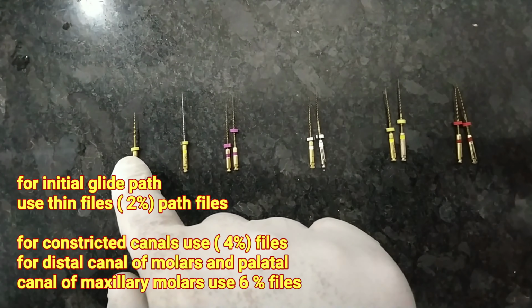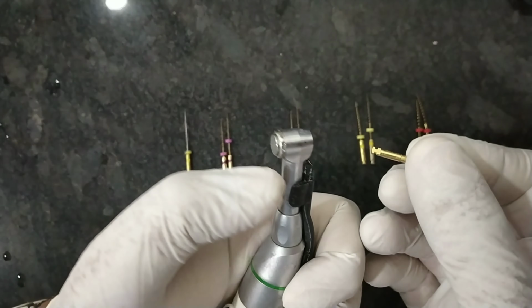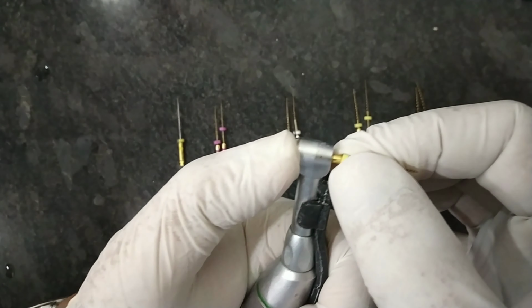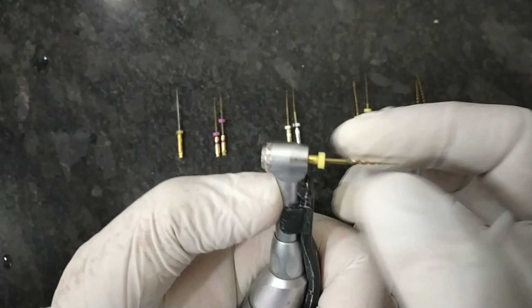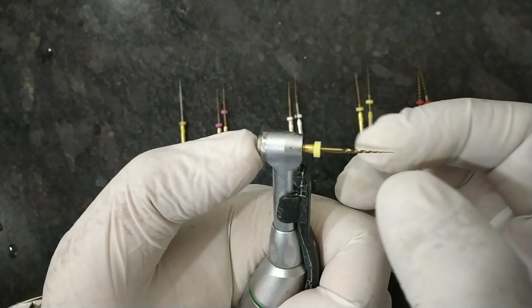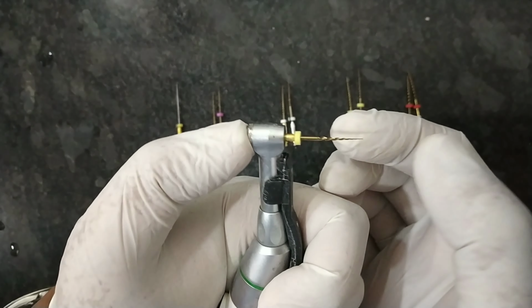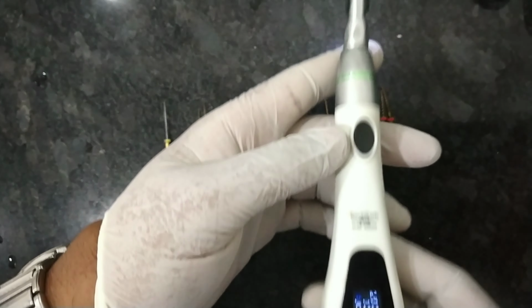So this is the SX file, and this is the way we are inserting it in the endomotor. You just have to press this button and insert it, and you can hear a slight sound which ensures that it is nicely stuck to the endomotor. What happens sometimes is when you are using it on the patient, it gets off from the endomotor and gets stuck in the tooth, and it is very difficult to take it out. So this is the SX.